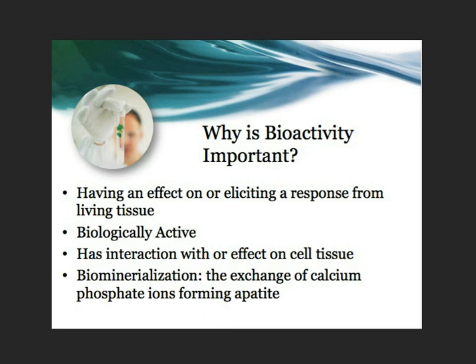Why is bioactivity so important? Well, you can read the first 3 sentences here on the slide about the biologic activity and eliciting a response. The important thing for us in dentistry is biomineralization, the exchange of calcium phosphate ions to form apatite. That's really what bioactivity is all about in today's world. It's not just hydroxyapatite being changed to fluorapatite.